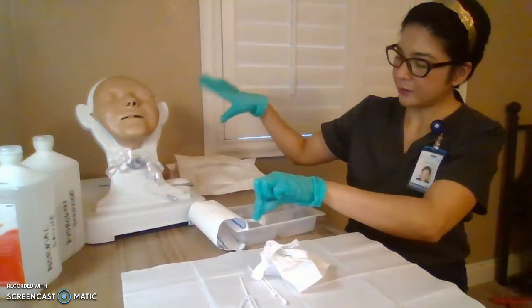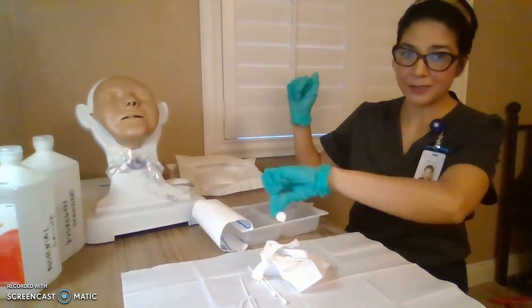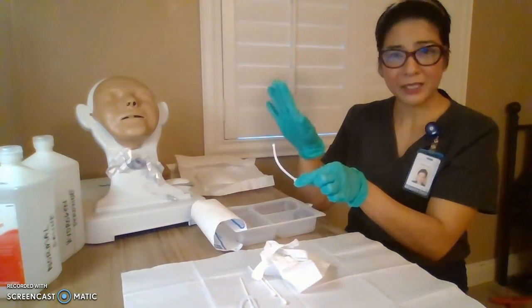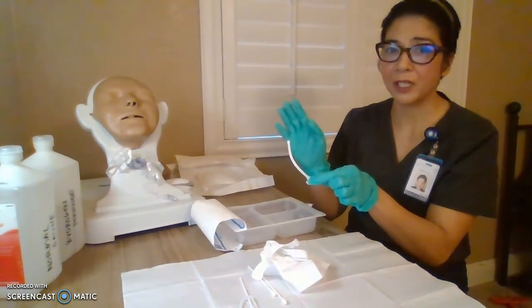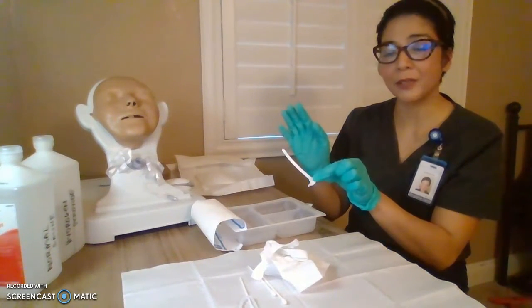Okay. Throw. And now we're going to rinse in our normal saline solution only. Rinse, tap, tap. The trachea site inside is a humidified environment, so you don't really need to dry this fully, since it's going in a humidified environment anyways, all right?